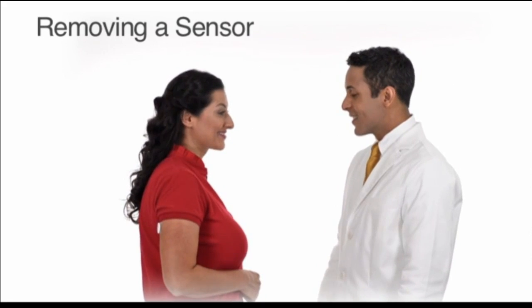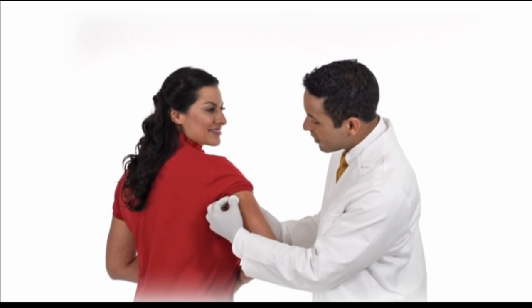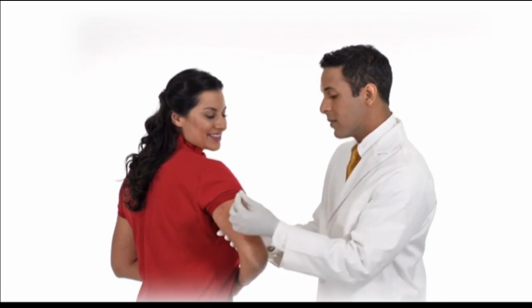Removing a sensor: pull up the edge of the adhesive that keeps the sensor attached to the skin, then slowly peel it away from the skin in one motion.